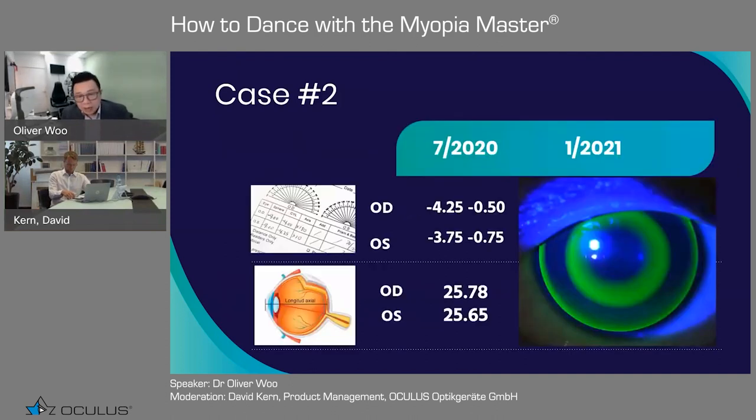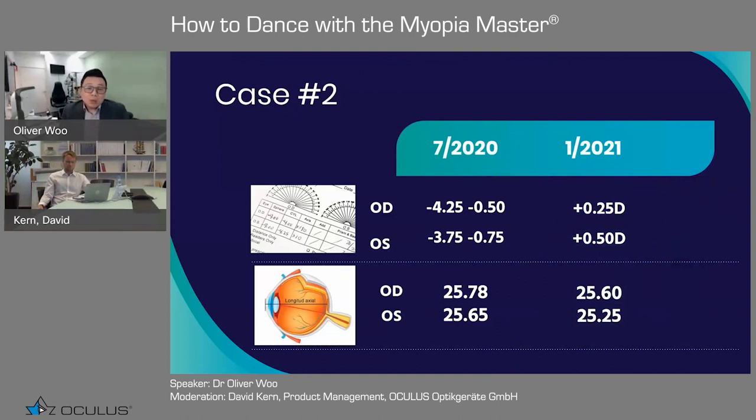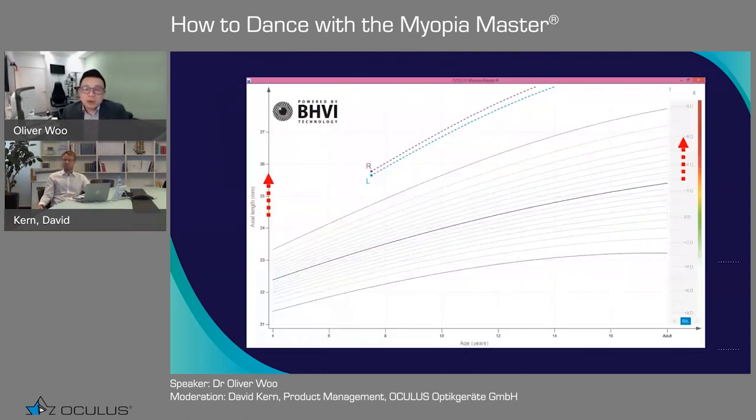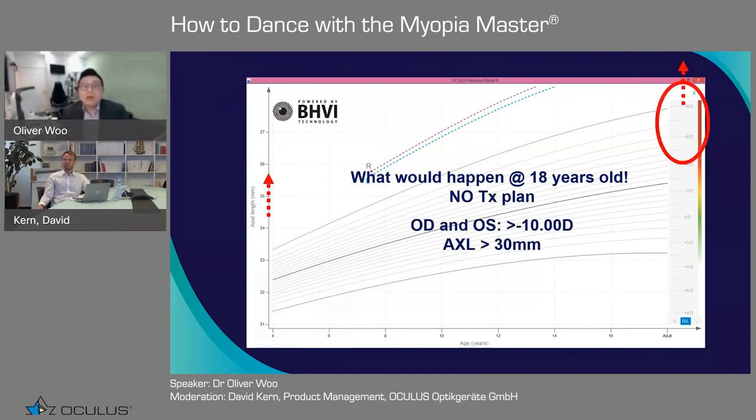So this is how the eyes look after ortho-K. After about five, six months, that's really, really nice. Axial length shortened, because we know that about orthokeratology. It's something where we know how we can change the eye size as well. I mean, a lot of myopia control products will help us to slow down the axial length changes and also shorten the eye size.